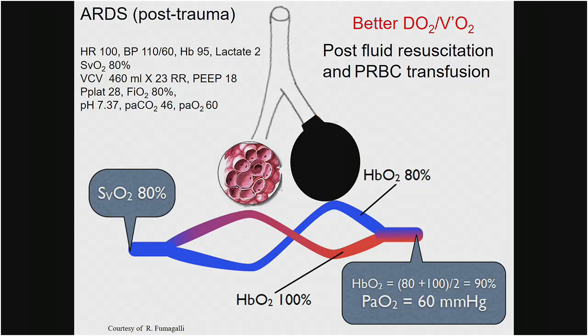So here we are matching the delivery, as written in the delivered oxygen in red in the upper side of the slide, the ratio between oxygen delivery and oxygen consumption. Next slide.